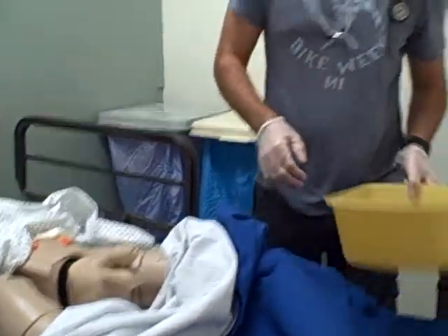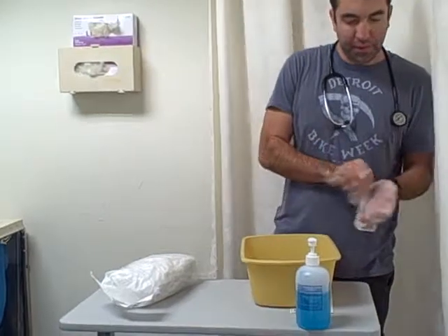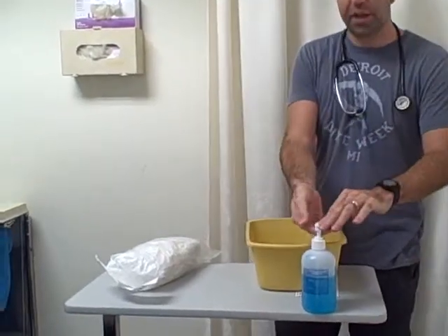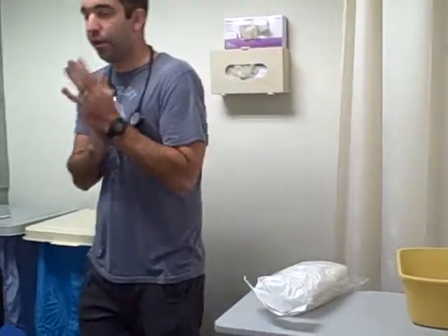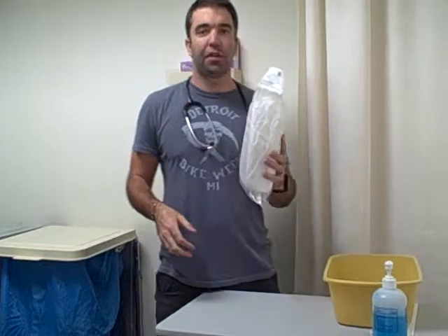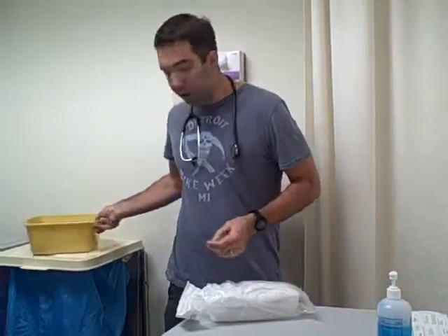Okay. So clean that. Take off my gloves. Hand hygiene again. Then I'm ready to start with my straight cath. So I have my straight catheter kit here. This is a sterile procedure. So I'll just move this over.